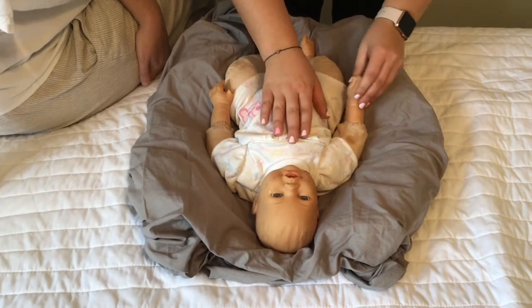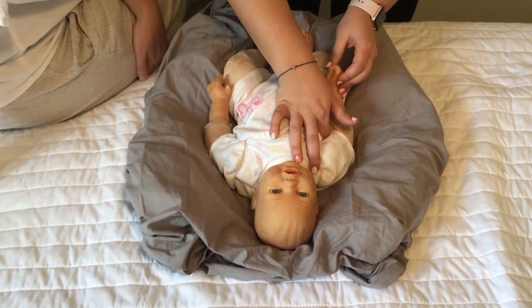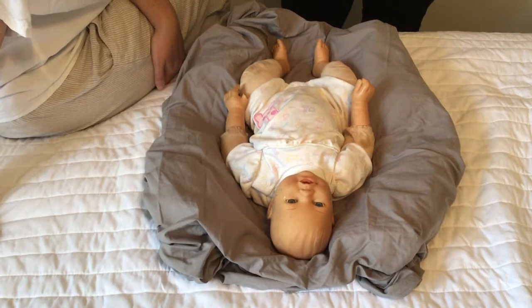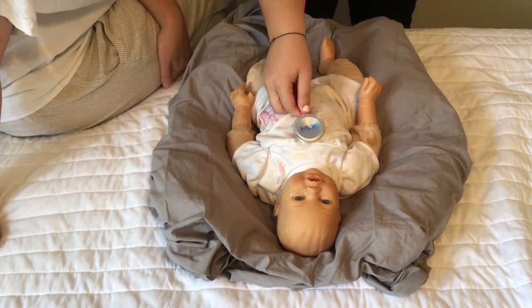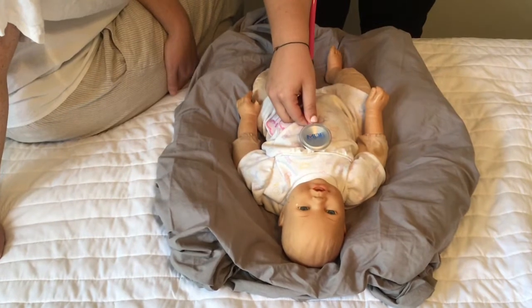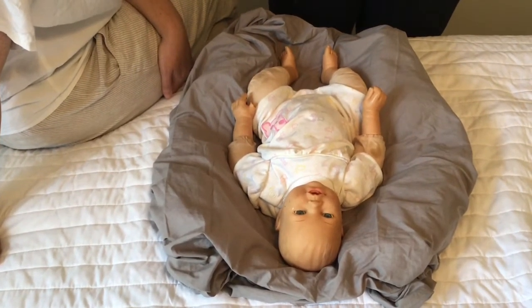Respirations of 40. We're next going to obtain an axillary temp, which goes right in the middle of the armpit. 98.6. We'll next listen to the apical pulse. To obtain her pulse rate, make sure you warm up your stethoscope prior to placing it on the baby. Again, we're going to listen for a whole minute. Pulse rate of 146. All right.